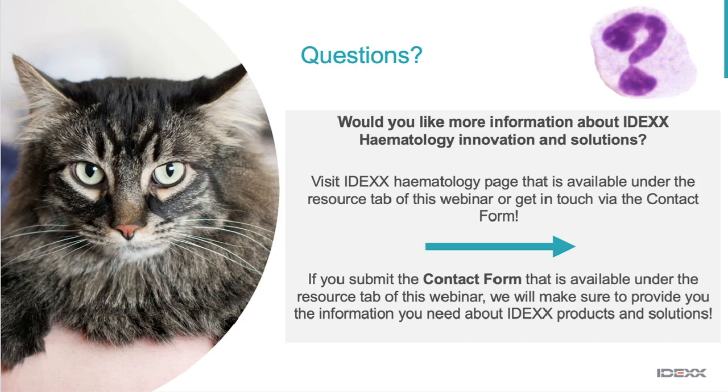Now, remember the situation in the cat, that if you have a mild anemia, with a manual packed cell volume or hematocrit a little above 20%, but below the low end of the reference interval, that's the problem area we have in the cats, because none of our analyzers can count those punctate reticulocytes correctly. And this is where you really need to put it into one of two buckets, non-regenerative or regenerative.